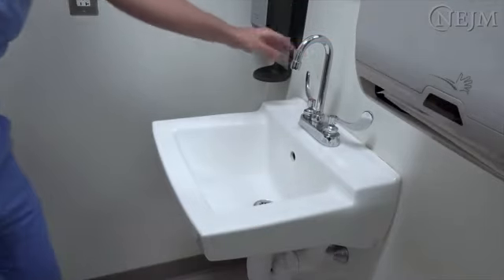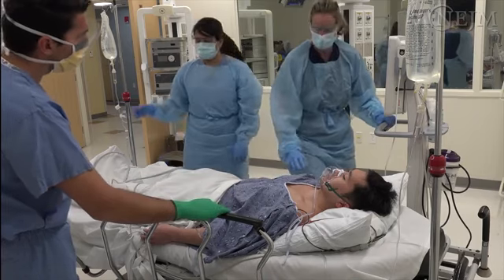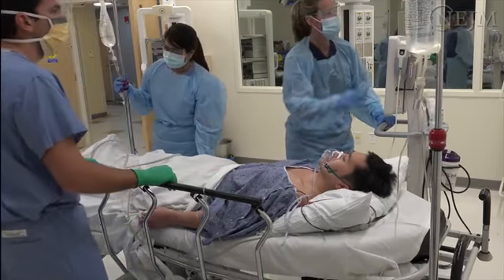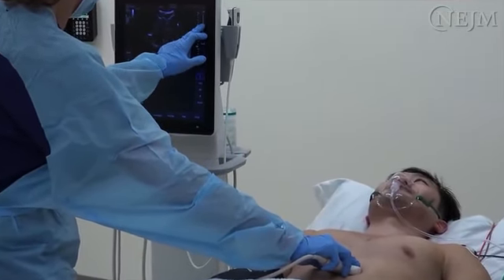Before beginning EFAST examination, wash your hands and put on required protective equipment. Place the patient in the supine position, adjusting the bed or examination table to the level of your waist. While performing the scan, use one hand to manipulate the probe and the other hand to operate the ultrasound machine.